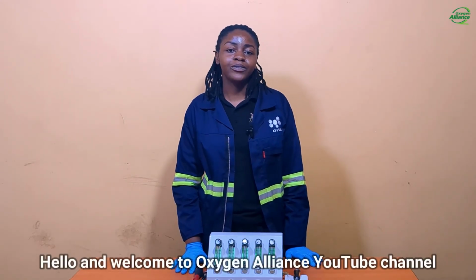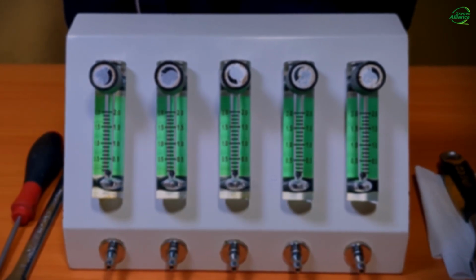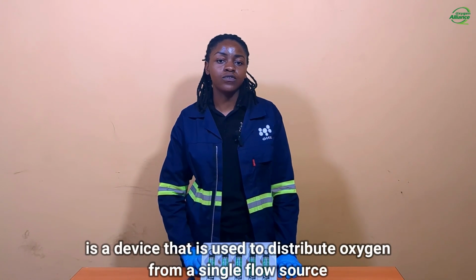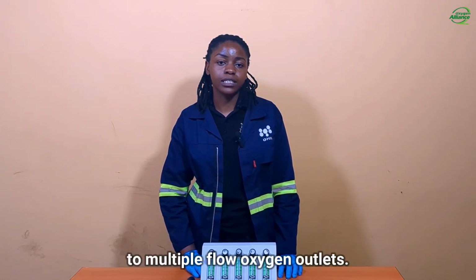Hello and welcome to Oxygen Alliance YouTube channel. My name is Janet Jalera, a biomedical engineer working with OpenO2, and today we will go through a teardown of an oxygen flow splitter. So an oxygen flow splitter is a device that is used to distribute oxygen from a single flow source to multiple flow oxygen outlets.